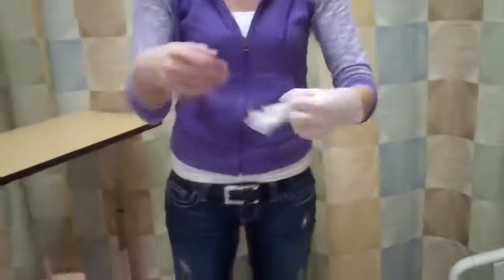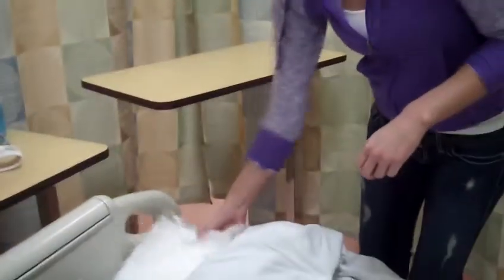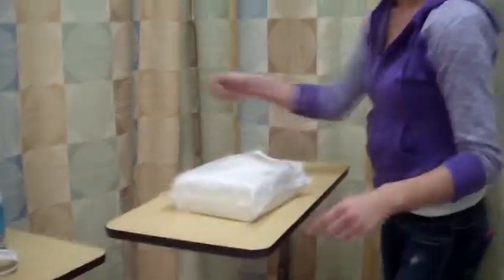So then I'm going to remove my clean gloves. Put these in the trash. Cover her up while I get my supplies ready. I'm going to take this kit over to the bedside table.